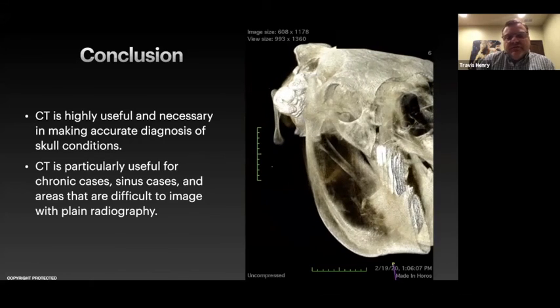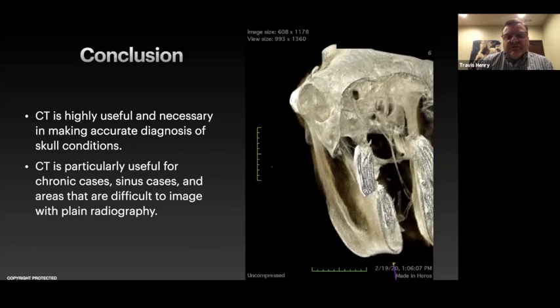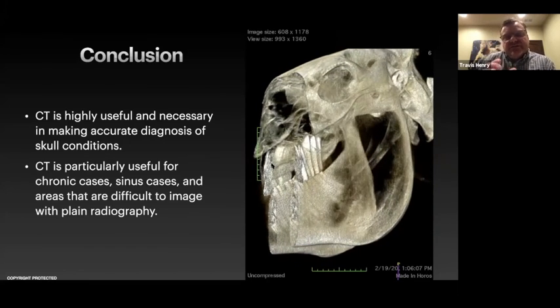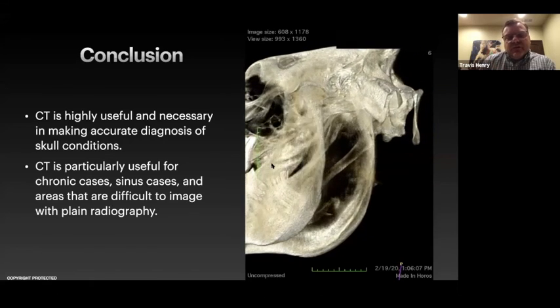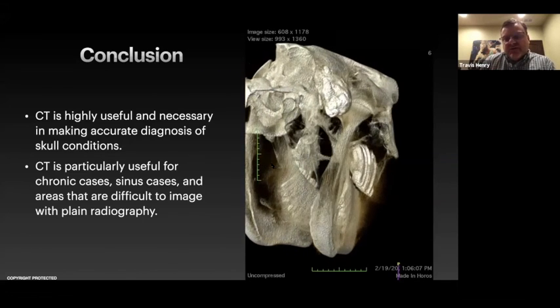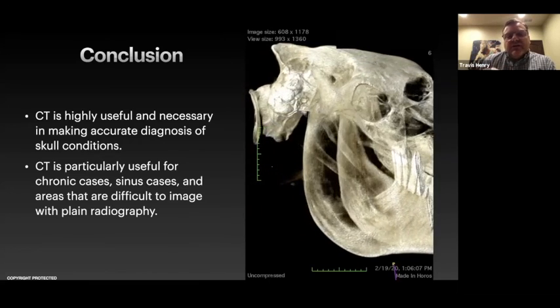And don't forget to take some plain films and compare them with your CT, because you can get some summation with the films that you don't with CT. But on the other hand, you can go back to those MPR images and you can stack up several slices together as well and look at more information. That might be kind of confusing, but just think about a lot of what we're looking at here today is just individual slices, where you can ask the computer to build those into 3 and 4 slices together, and you can look at a bigger area all at once.